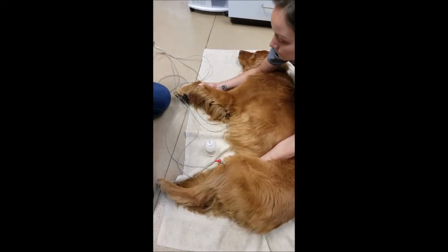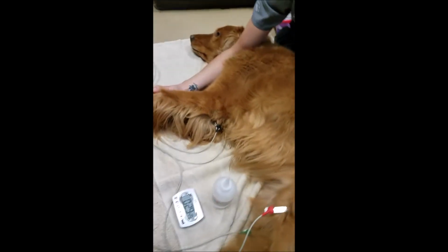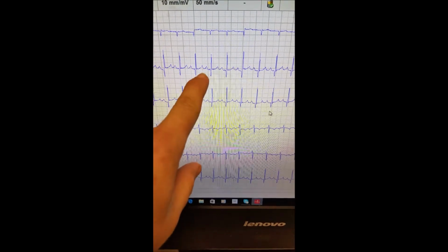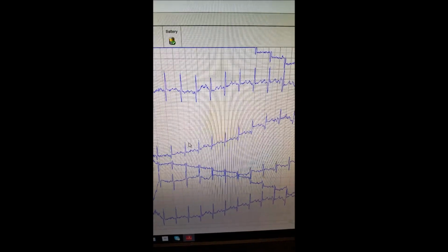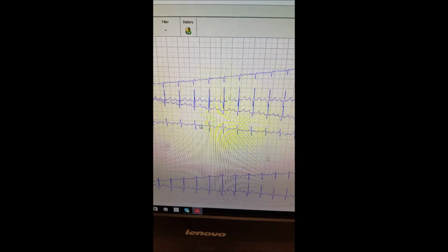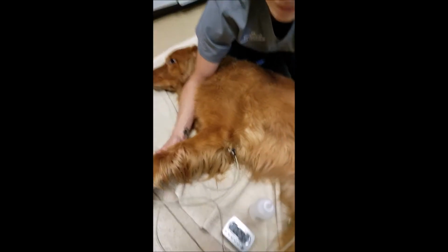Alright, so now he can stay still. And I'll go ahead and set the timer for 30 seconds, which is what we need for a good reading. And now that we're obtaining our reading, you can see over here what is happening. So we have the PQRS complex. They're all steady with each other. There's no P without a QRS complex. And so this is our reading that we're needing, making sure that we have a good electrical conduction system through the heart. Okay, so we've got our 30 seconds. And that is doing an ECG reading on a dog.